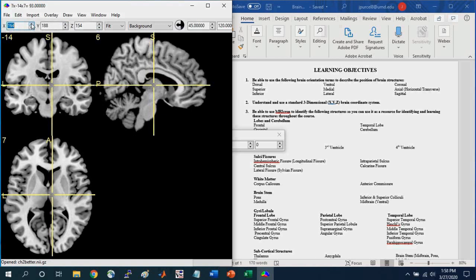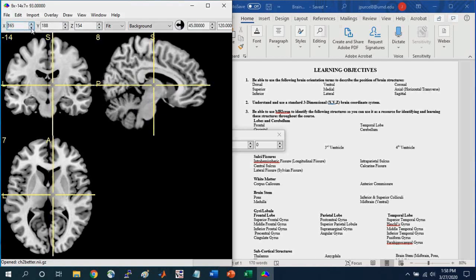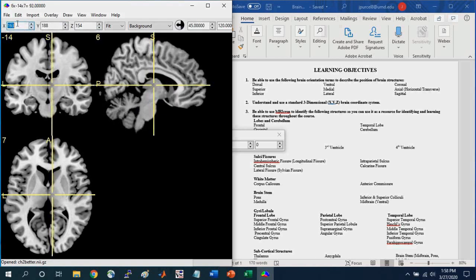So what these are are essentially the coordinate system of the brain file itself. So not necessarily standardized. It's going to vary depending on, say, the resolution of the brain file.